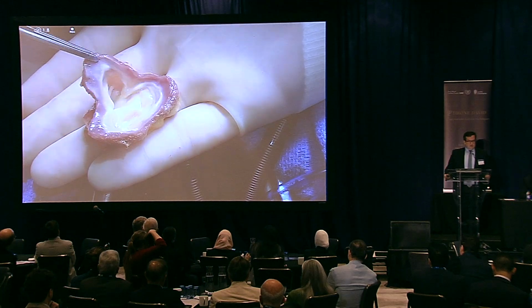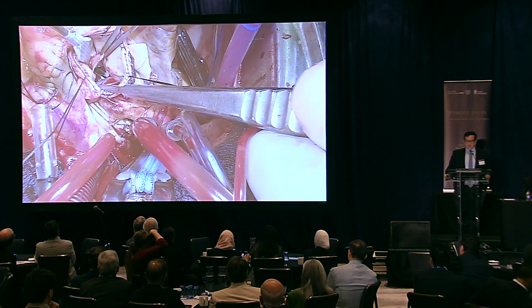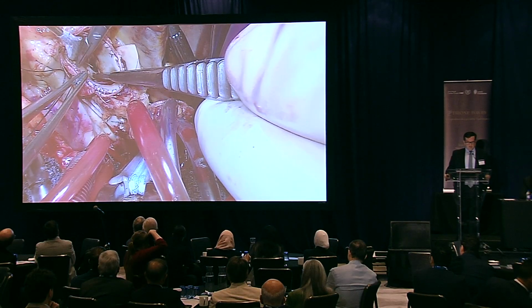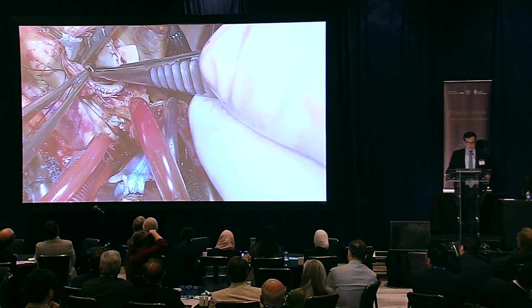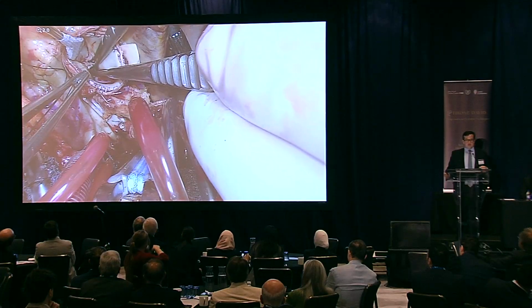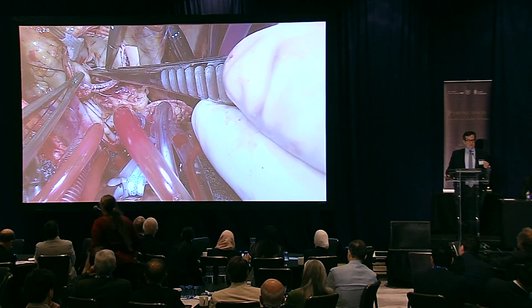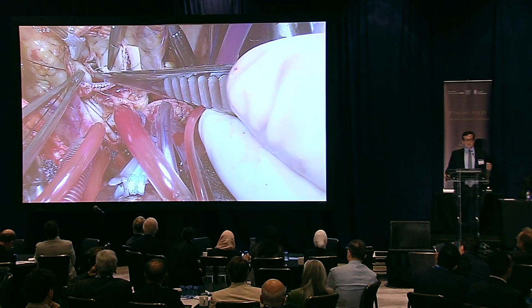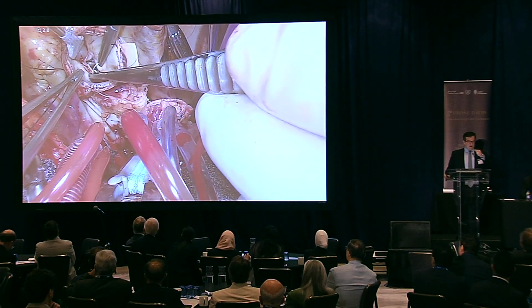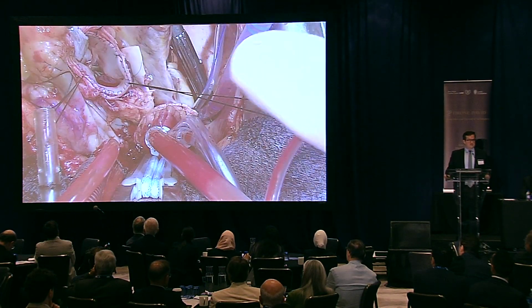So you can see the pulmonary valve is normal, looks symmetric. And then what we do is we reclamp and we open the graft. I'll touch on that in a minute, but you can see that even with commissural resuspension, it's not like an aortic valve repair. There's no body to the leaflet. It's sub-millimeter thickness. You can't really do any sort of advanced analysis of the valve because there's just no body to it. You can't use a caliper in any real systematic way.